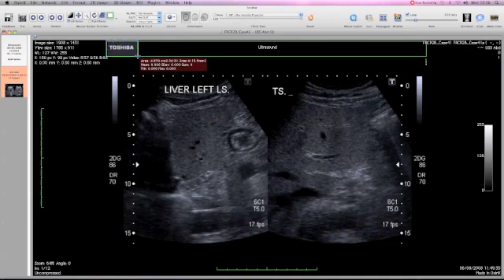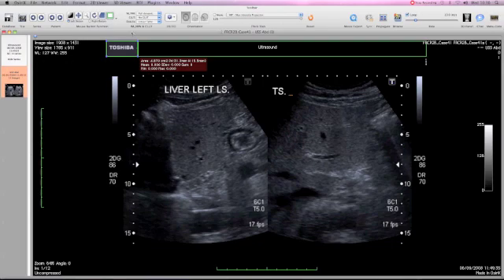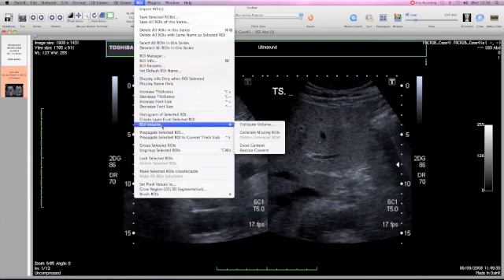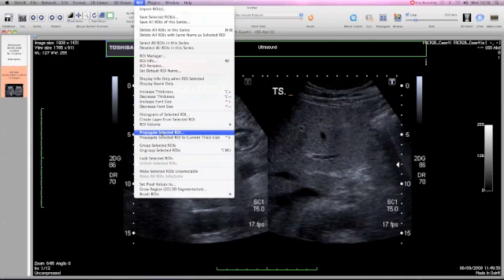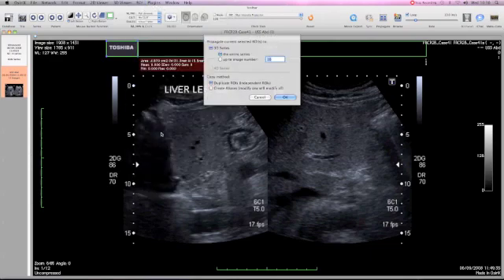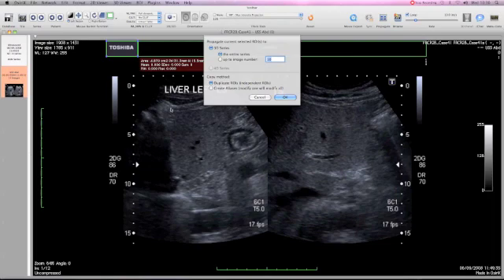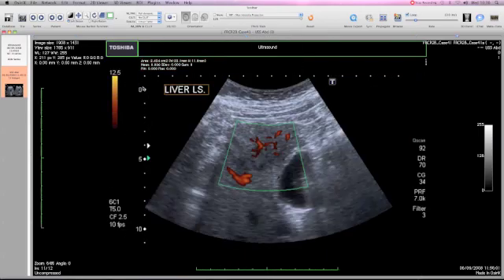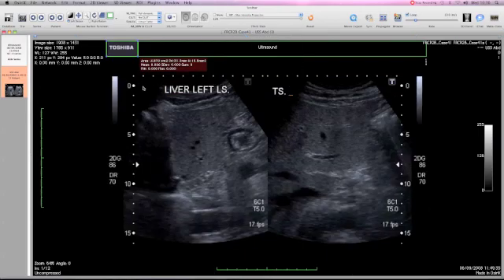The ultrasound will be part of a series, and we want to seed this particular process throughout all of the others rather than do it for each individual one. So we then move up to the region of interest icon, drop down to the propagation tool, propagate selected region of interest. Select this and choose the entire series because you want it throughout the ultrasound series and press OK. This will now appear on every one of the images.